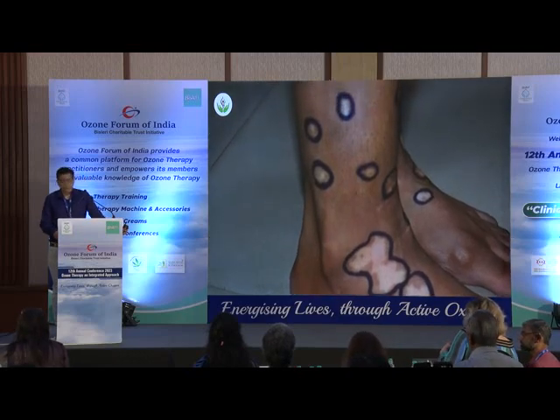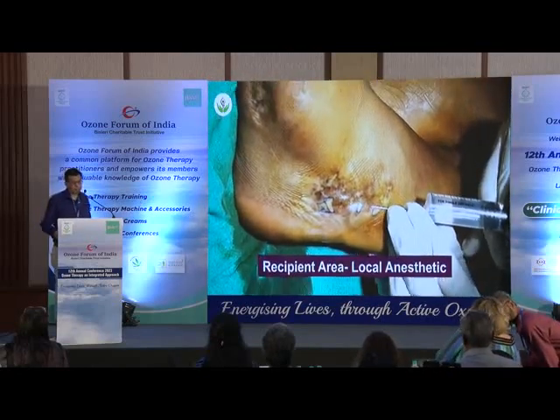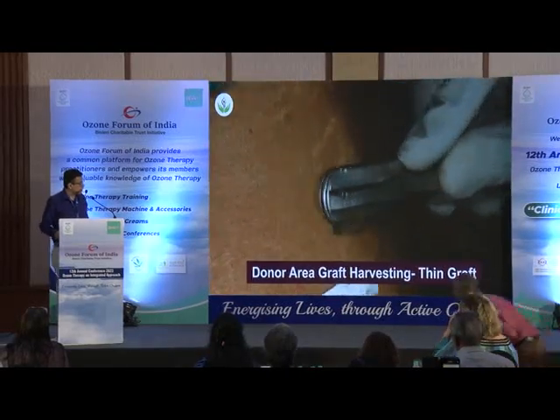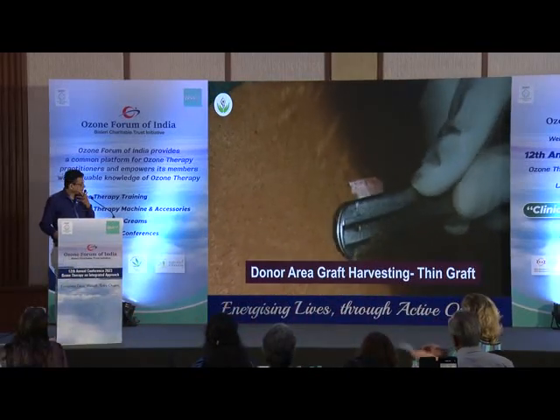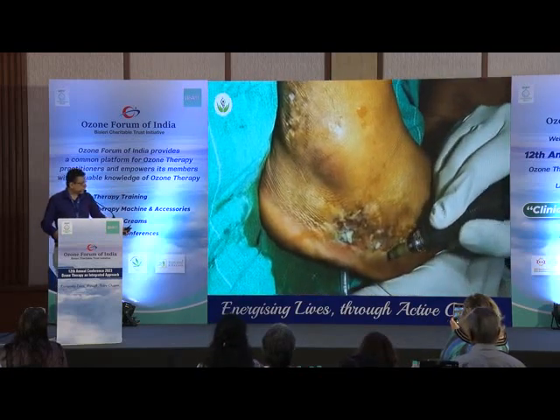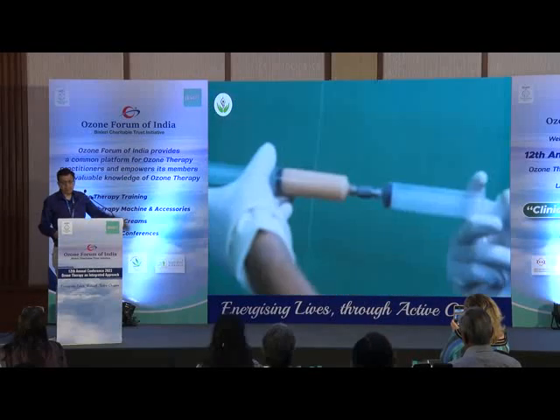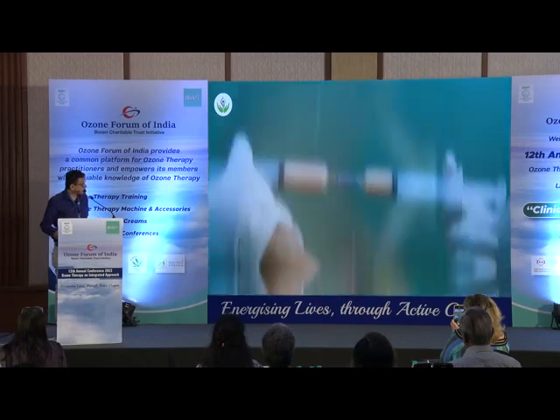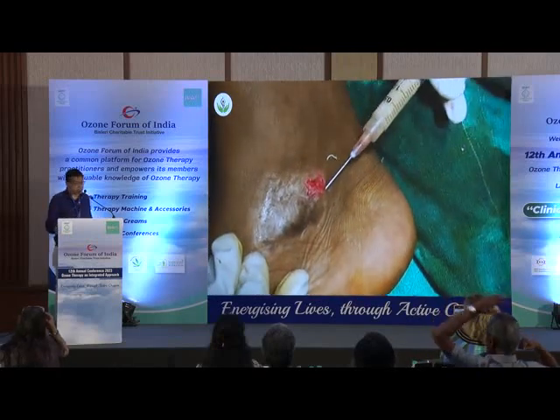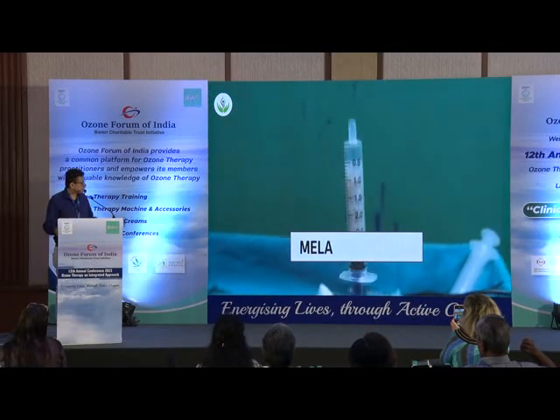This is melanocyte transplantation. This is the surgical video, what we do. You can see we're giving local anesthesia. This is a melanocyte transplantation surgery, how we do this surgery. A small graft, which is a split thickness graft. Dermabrading the white patches. This is fat grafting. You can see the cannula, and this is the fat. And the fat has stem cells, mesenchymal stem cells. I'm injecting the fat below these white patches. As I said, they have got mesenchymal stem cells. We don't have to do all this in every case, only in very resistant cases we go for this.